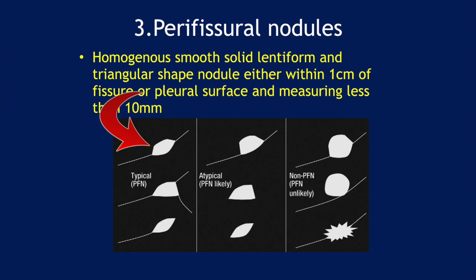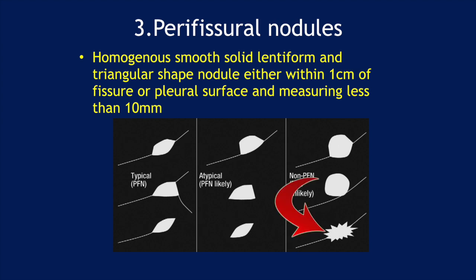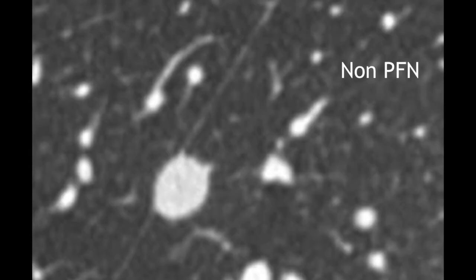This one is lentiform or triangular in shape. These are atypical — they may not be so lentiform or triangular but they are still very small, less than one centimeter. These are the non-PFNs; they are unlikely to be perifissural nodules because they are roundish or spiculated and larger in size. So here is a typical PFN and here is a non-PFN.